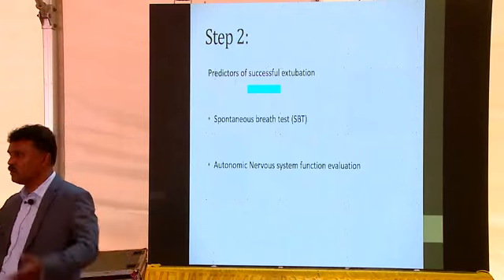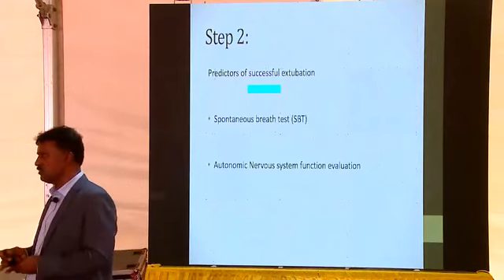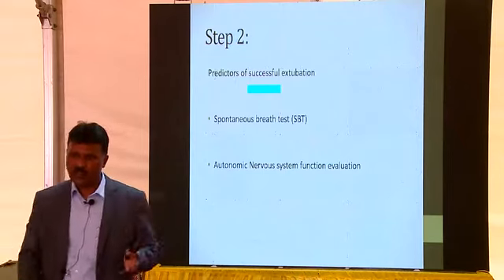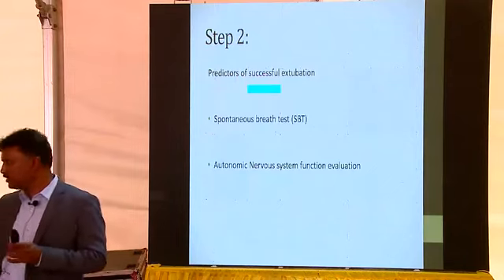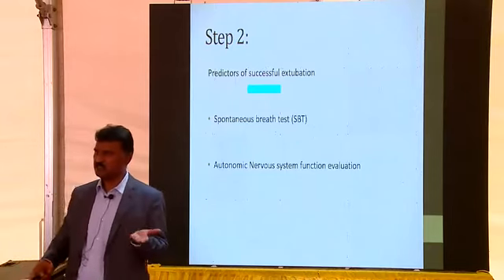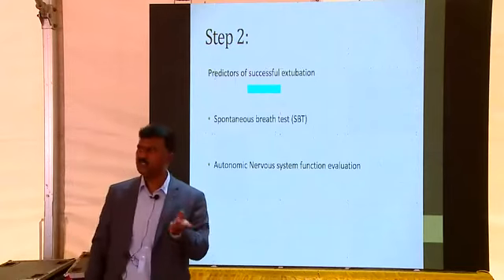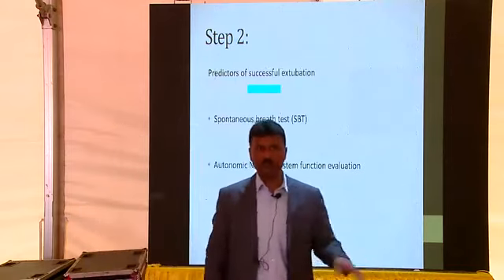Lot of the ventilation is traumatic, and there is mortality to the baby.